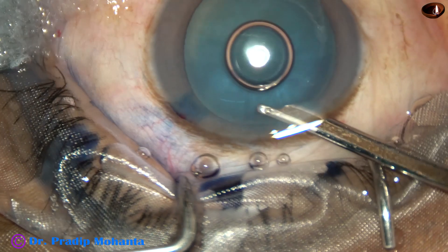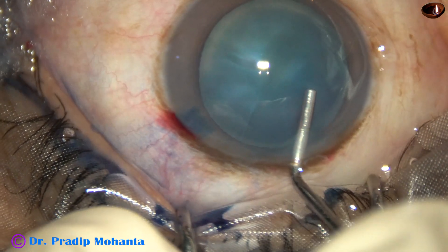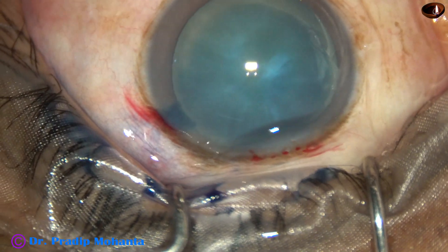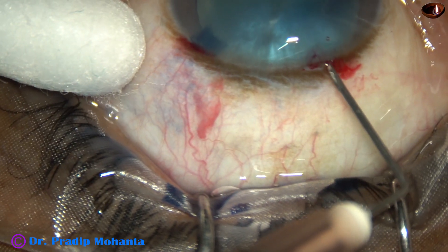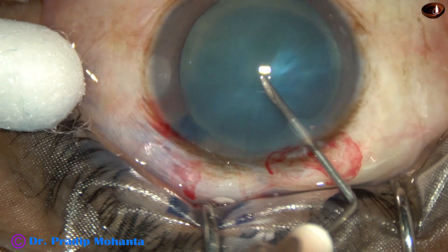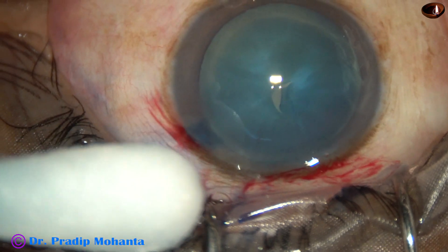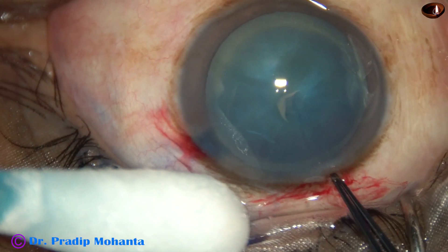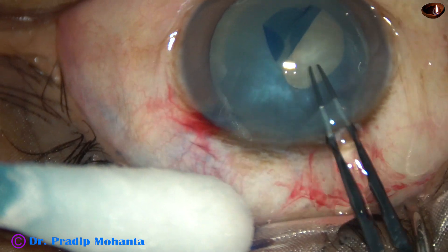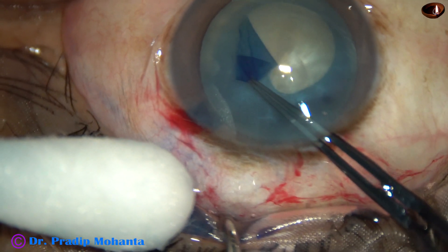I am going to use 2% HPMC as the viscoelastic substance. Visco has filled the anterior chamber and now I am going to do capsulorhexis. The anterior capsule is incised with a 26-gauge bent needle and the capsular tag is raised. I hold this capsular tag and in this case I saw there is no fluid came out, so there is not much intra-lenticular pressure. So I opted for rhexis on-the-go.